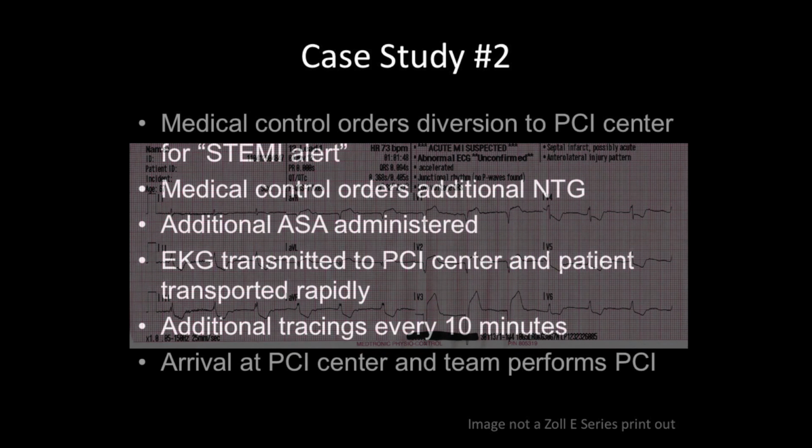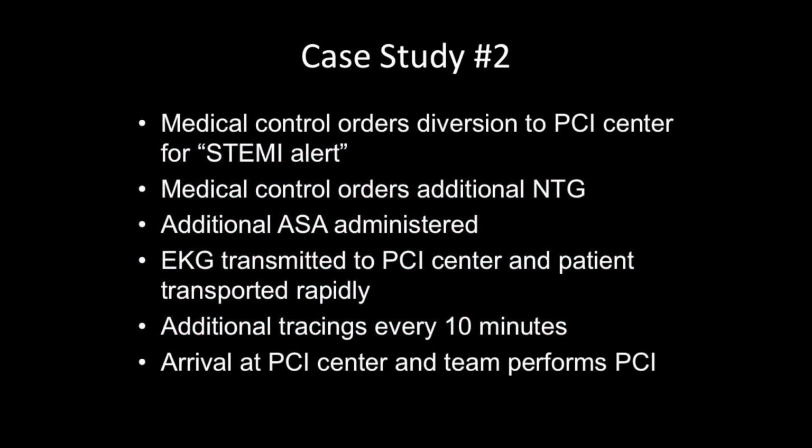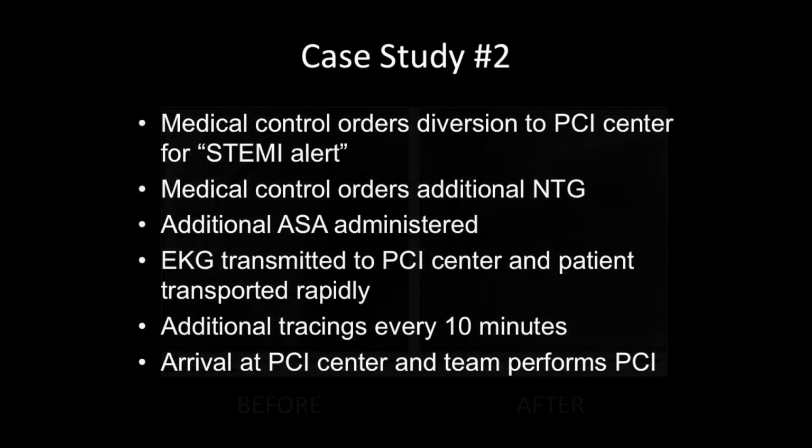So medical control, PCI diversion, additional nitro administered, PCI, tracings every 10 minutes, arrival, okay, and you go to the thing, okay, and there we go. And so this is, hold on, TIMI 3 flow, blah, blah, blah.